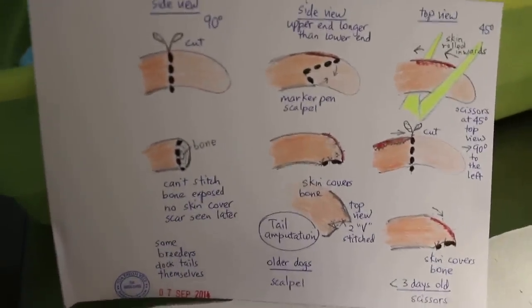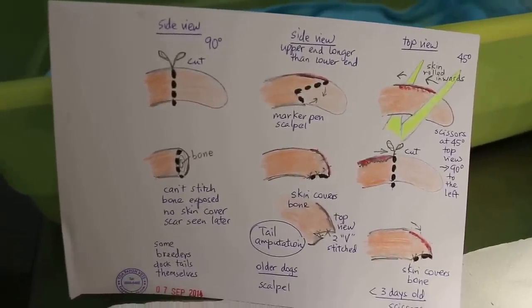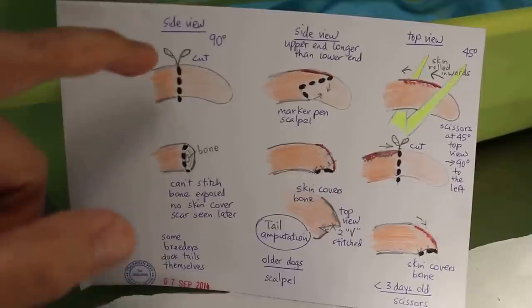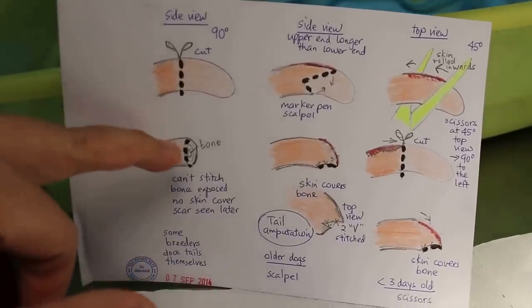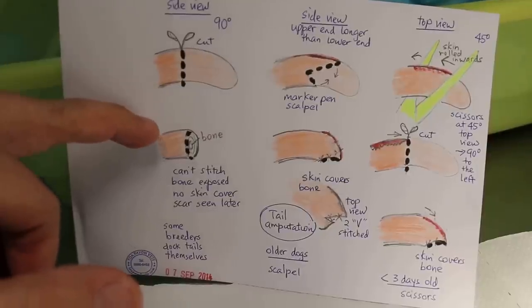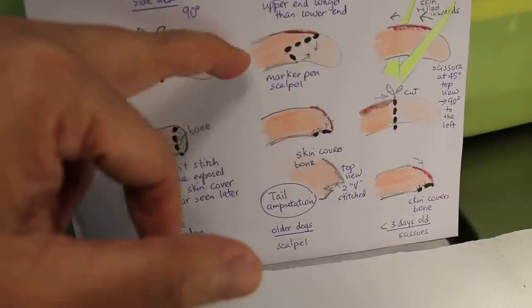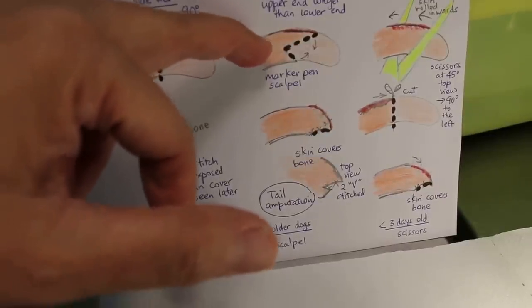Tail docking in dogs, or tail amputation. There are three ways of doing it. One way is just a straight vertical cut — this is what breeders do. You can see the bone after that. This is no good for the dog.